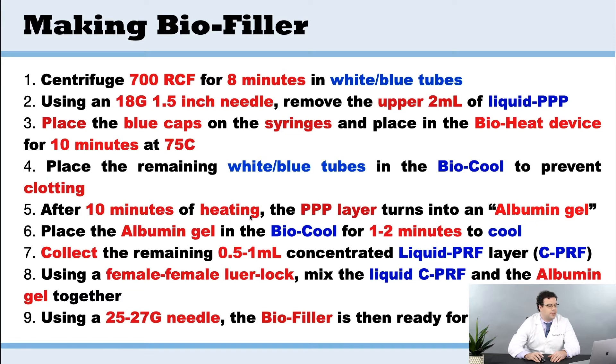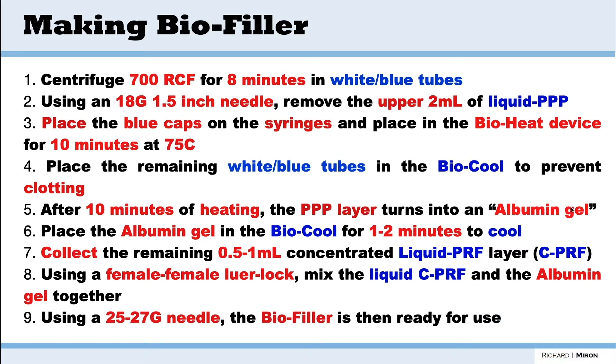After 10 minutes of heating, that PPP layer turns into what we call albumin gel — you'll see the consistency is different. We then take the albumin gel and place it into the bio cool for one to two minutes just to cool it, and then we take the remaining 0.5 to 1 mL CPRF that we've previously seen and mix them together.